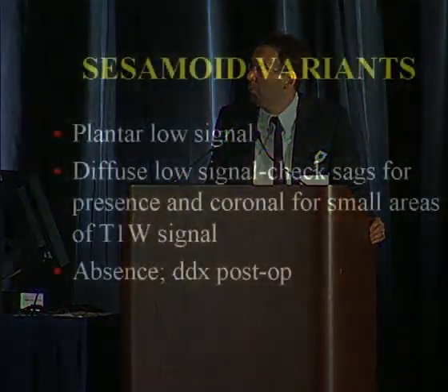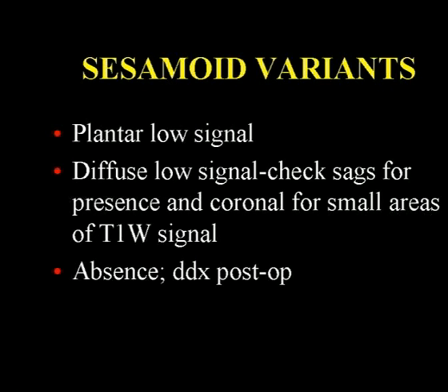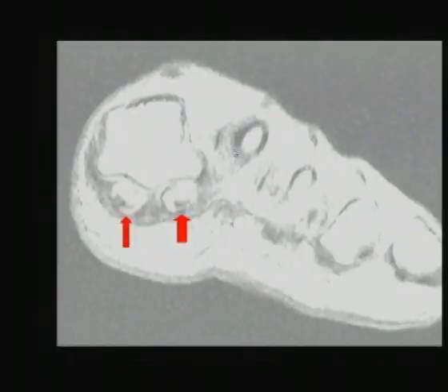Like everything in radiology, there are normal variants. The most important normal variant is low signal within the sesamoid. This can be diffuse but is usually epicentered at the plantar aspect. If you volume-average through this, it can make you think there's AVN or sesamoiditis, when it really is a normal variant — likely chronic stress changes with thickening of the cortex.